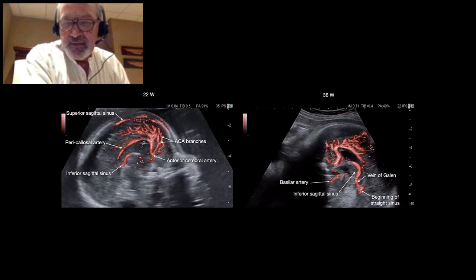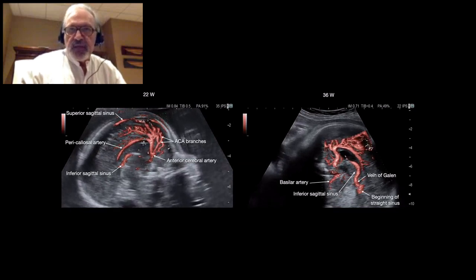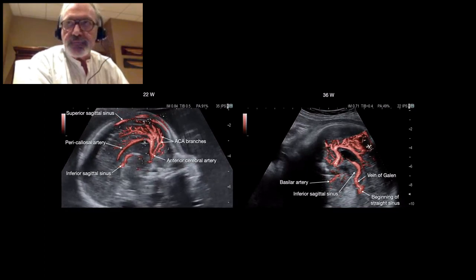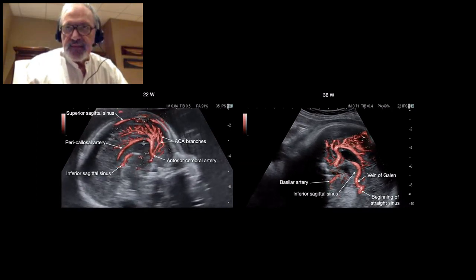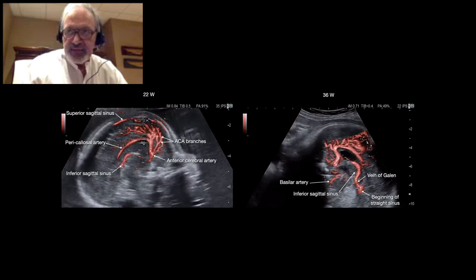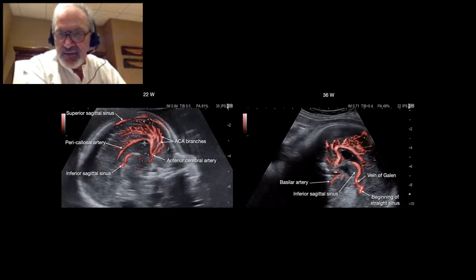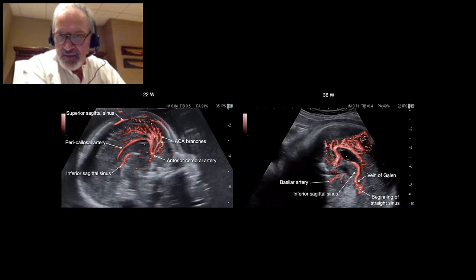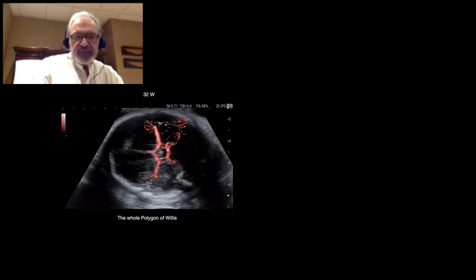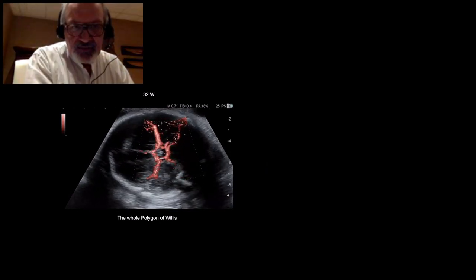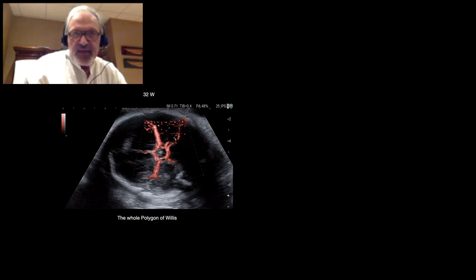Here, late in the pregnancy, we can see the basilar artery just in front of the midbrain. You can also see the inferior sagittal sinus extended by the vein of Galen, then the straight sinus, the beginning of the straight sinus. As you can see, the pericalosal artery is fully filled with the signal. In transversal view, it's very easy to have the whole polygon of Willis and the mid-cerebral arteries.